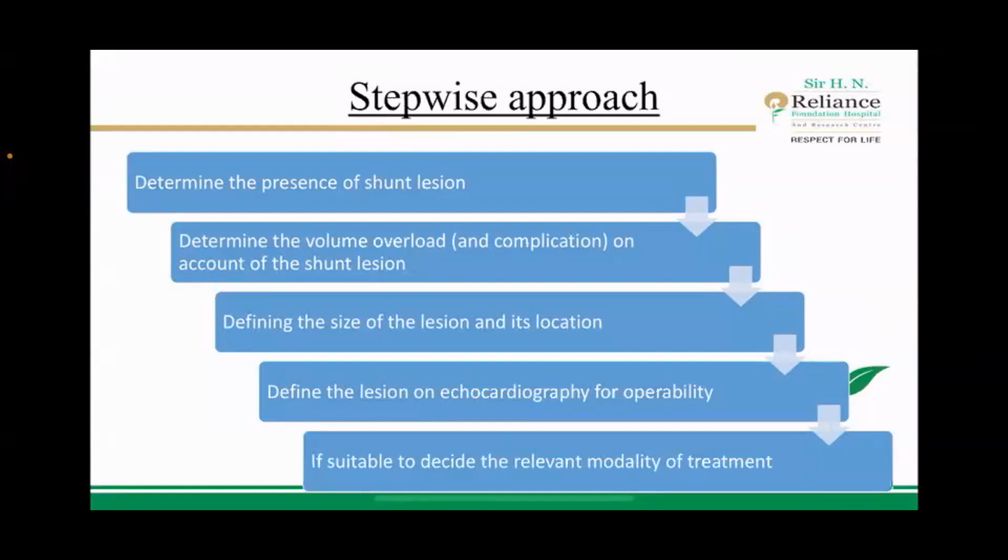How much is the shunt fraction? How much is the QP-QS ratio? More than 1.5:1 is considered significant for a left to right shunt. And if suitable, decide the relevant modality of treatment.